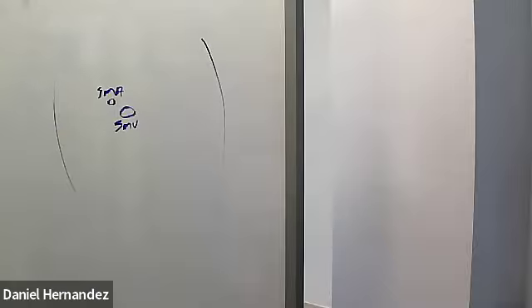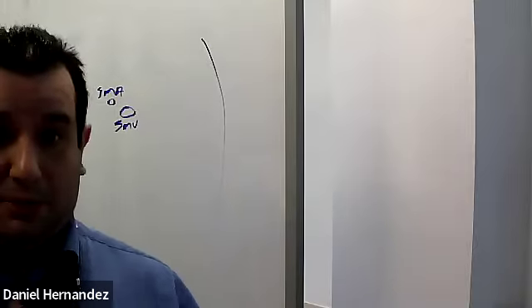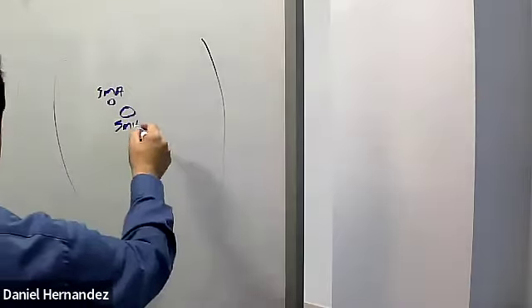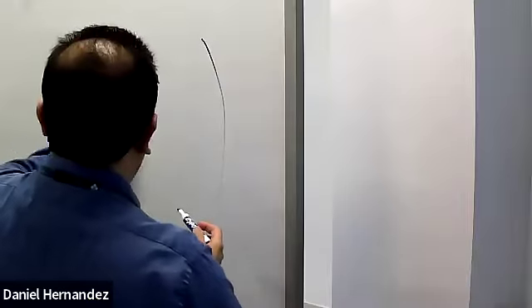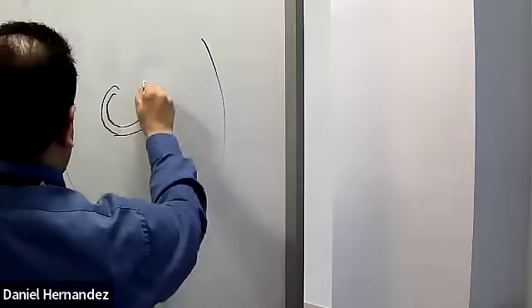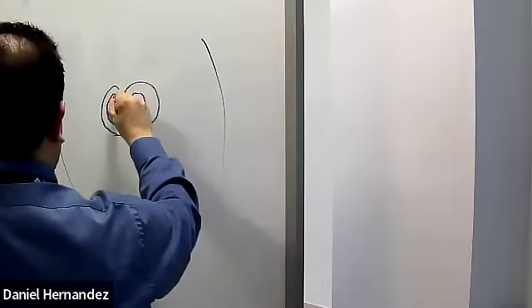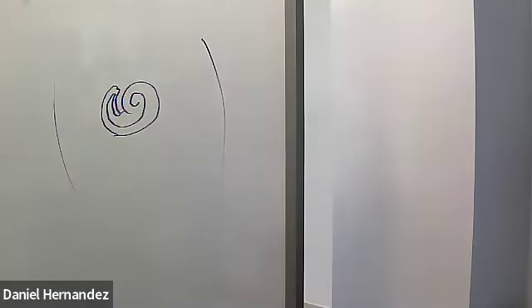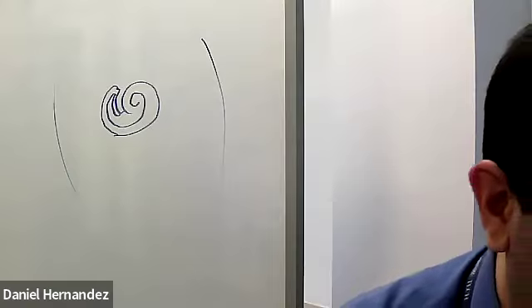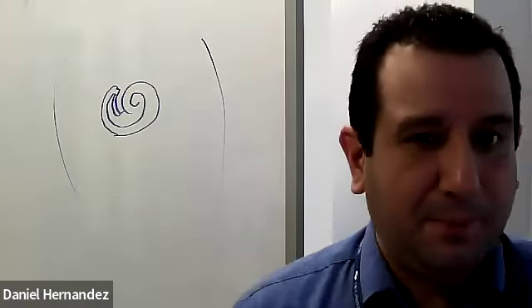That's one of the things that they look for. This will create what's called a vascular swirl. So I turn on that, like these vessels now are twisted, so that's in transverse. But in sagittal, right along that, you could see the vessels actually kind of doing a swirl. So you get this swirl of vessels. When you put color on it, you see what's called a vascular swirl. It's another way you can make that diagnosis for midgut malrotation.